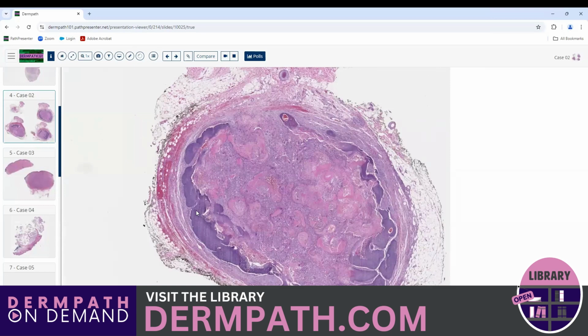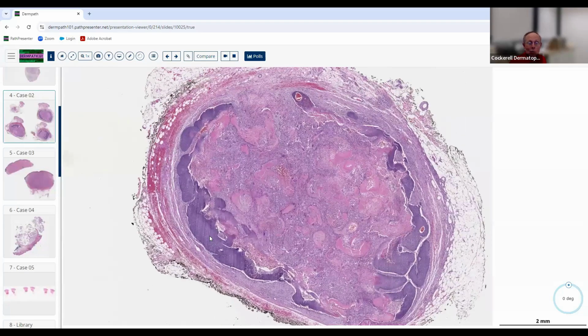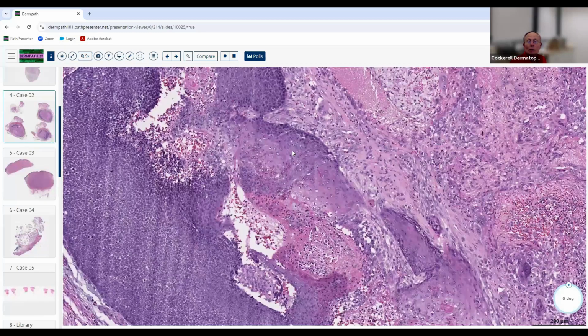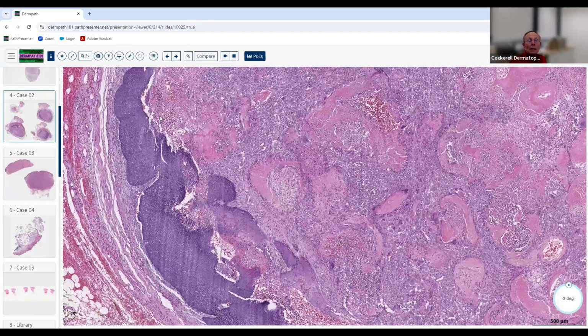I think this one is follicular. Good. Yes, follicular. That certainly doesn't look eccrine or apocrine at low magnification. We don't really see any apocrine decapitation secretion. At higher magnification, we certainly don't see any of that. Okay, so we think it's probably follicular.